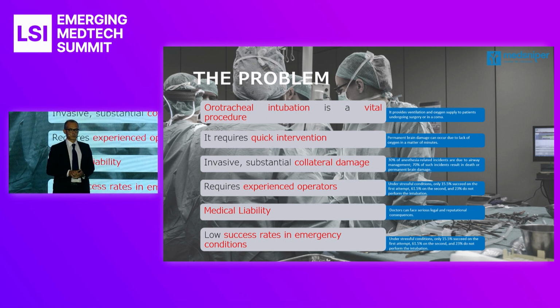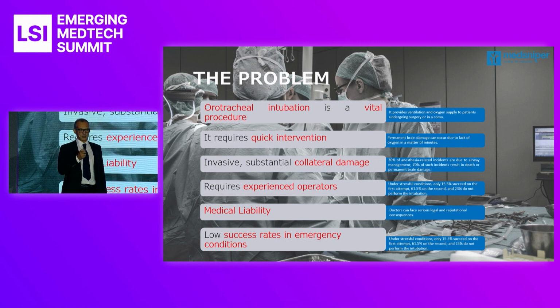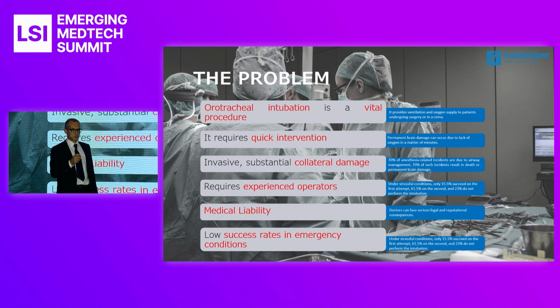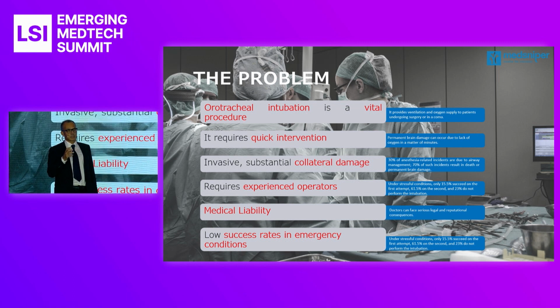As you probably know, but let's make a little recap, orotracheal intubation is something where you have to use your strength to stretch the tissues and to align your eyes with the vocal cords to place the tube. It's a procedure that is traumatic, not only on the throat, but maybe traumatic for the neck, in an accident, in a motorcycle accident. Moreover, we have a low rate of success in emergencies, and this is a problem. Low rates of success, even at first attempt, in obese patients.